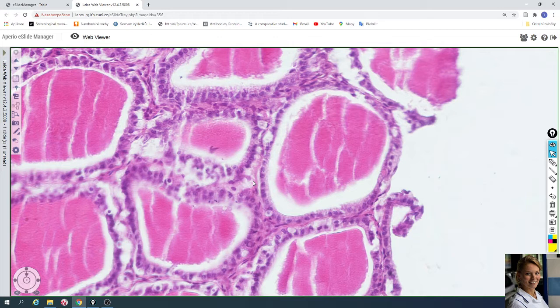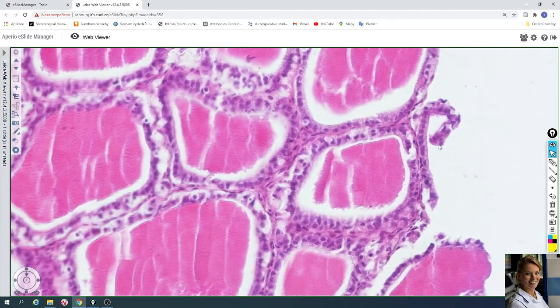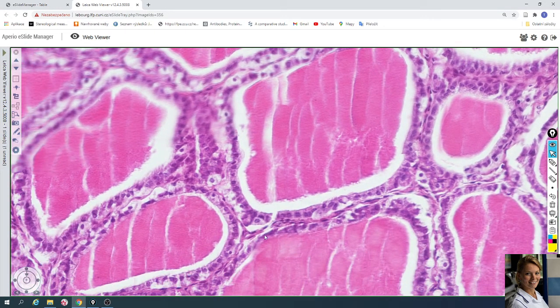Within the thyroid gland are also found parafollicular cells. The parafollicular cells are paler cells that present singly or in small groups. For example, here is a parafollicular cell — here is a parafollicular cell with very light cytoplasm. The rest of the cells are follicular cells.